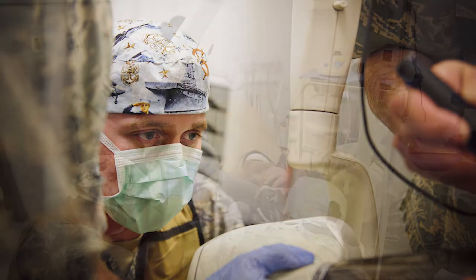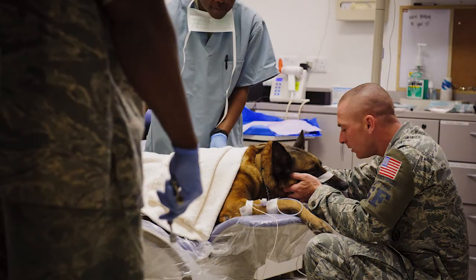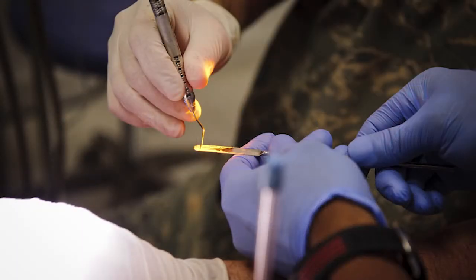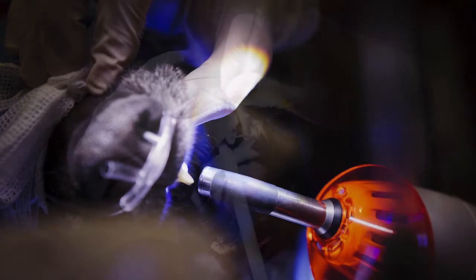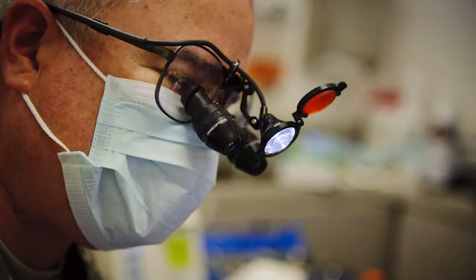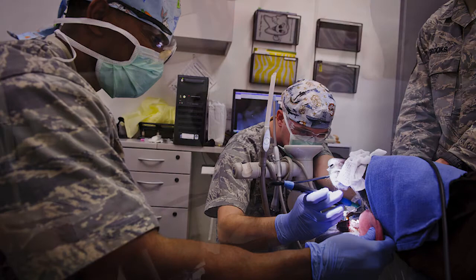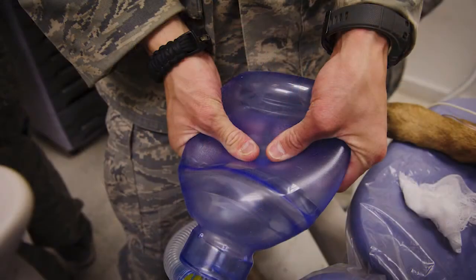In the case of Roy, we used a composite restoration, which is a tooth-colored filling. Basically, what we do is we do an acid etch on the tooth and we use a mild acid to clean the surface and make sure it's nice and clean. Then we put a bonding material down and then put the filling material in there, shape that, cure it with a high-intensity visible light, and then finish the shaping with some of the instruments that we have and check the bite and make sure it's correct.